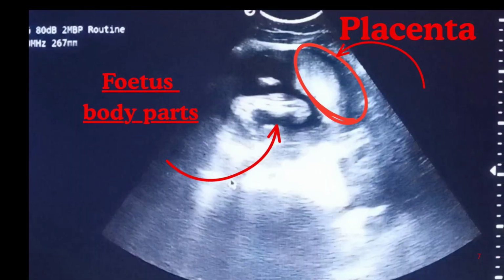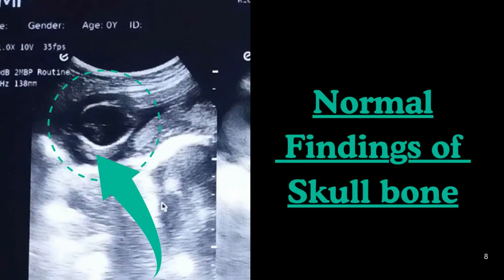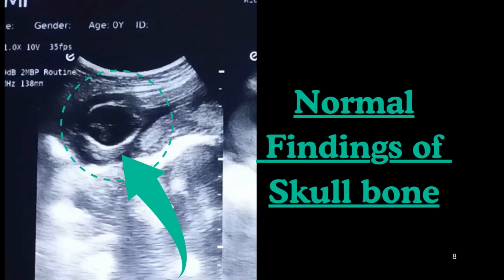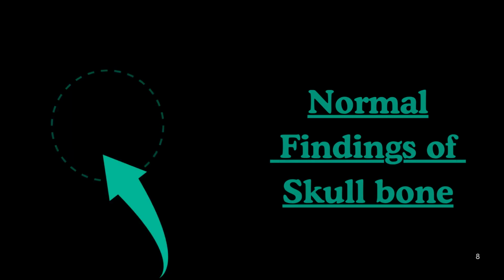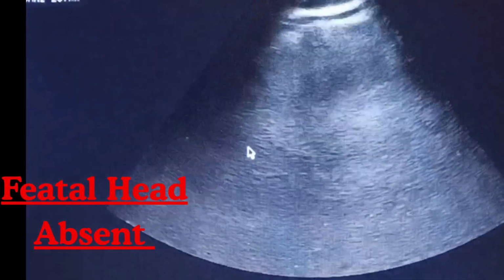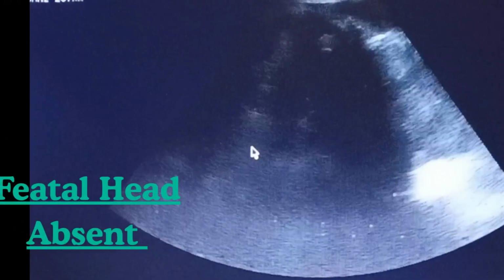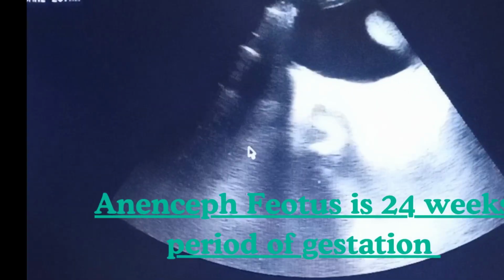As we begin the ultrasound examination, the first structure every radiologist evaluates is the fetal skull, which normally appears as a well-defined, circular or oval echogenic outline. The visualization of the skull bones helps in determining the fetal lie and presentation, whether the fetus is in cephalic, breech, or transverse position. But here in this case the skull bone is absent, which confirms an anencephalic fetus of 24 weeks period of gestation.